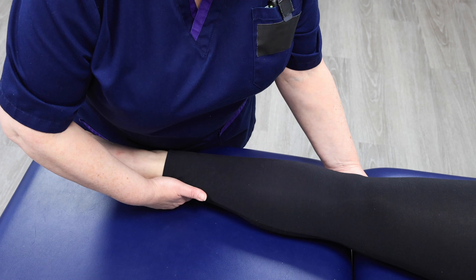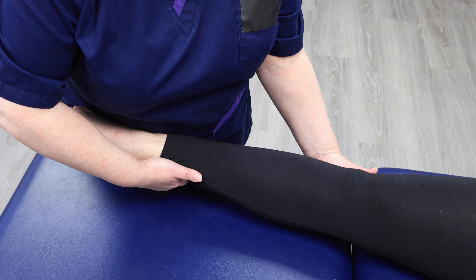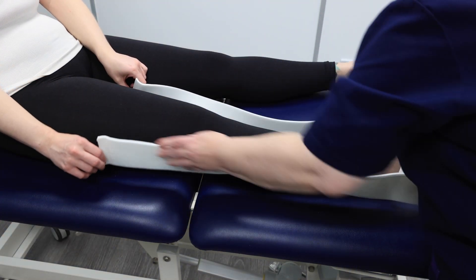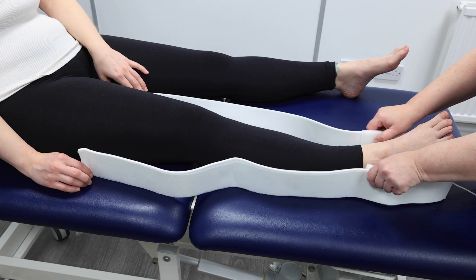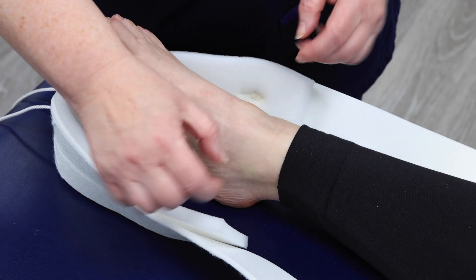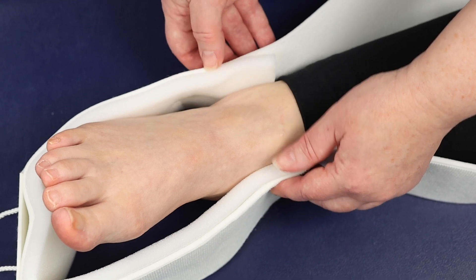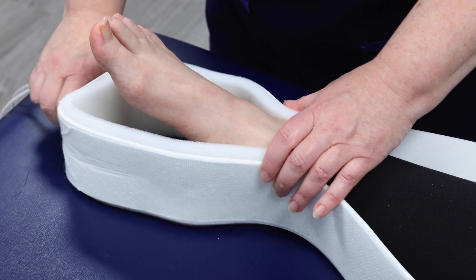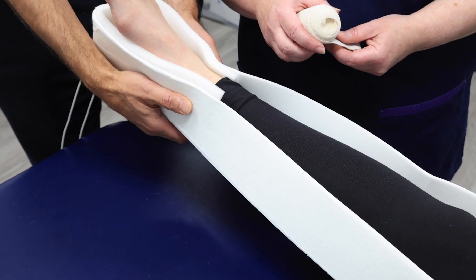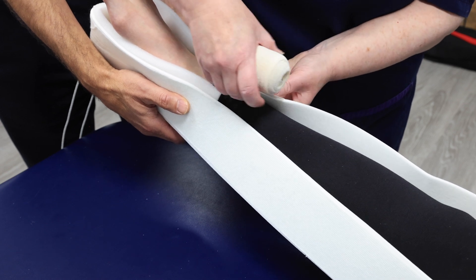One clinician should apply gentle traction to the injured leg while another applies the skin traction. Position the traction strip along the leg, ensuring the bony prominences on both sides are covered. Secure the traction strip using the included bandage, maintaining even tension.